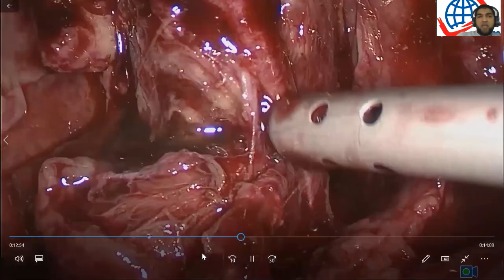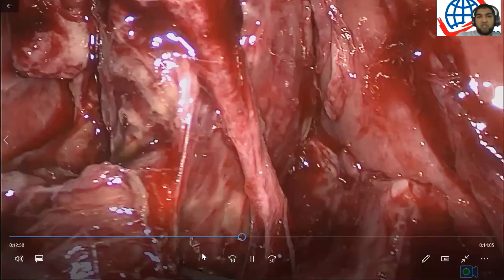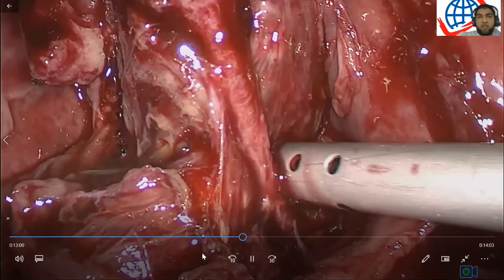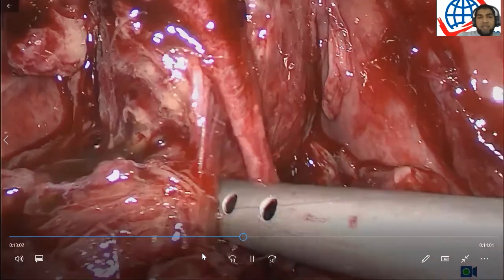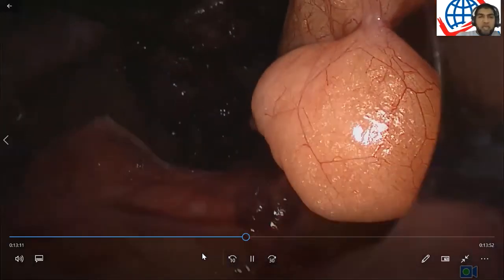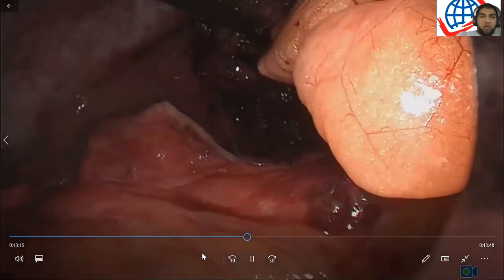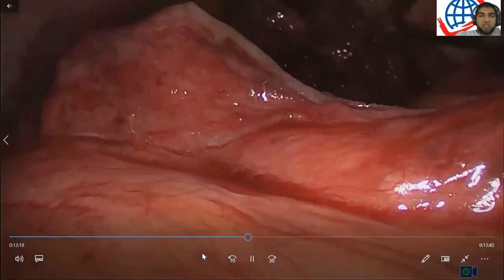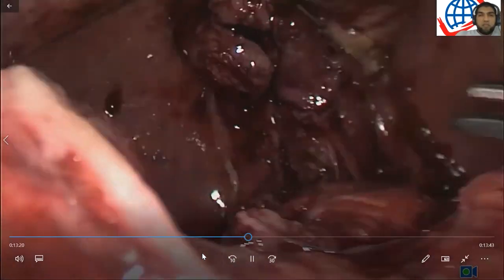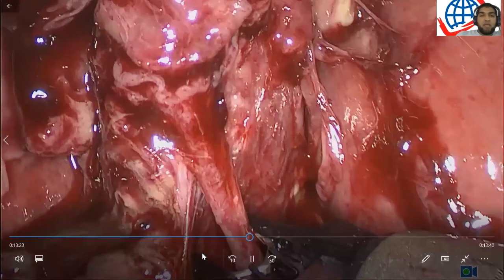So you can see as we're heading slowly down, we're keeping onto the gallbladder and we're slowly teasing the tissues away. There's a vascular structure at the front. We haven't cut yet. It's getting in our way a little bit, but we just want to see a little bit more before we know that it's safe to cut it. And I think that's one of the important things to mention. If you don't know what a structure is, don't cut it. Make room for yourself, make place for yourself, suction all of the free fluid, the blood, the pus, and then when you're happy, you can clip it.